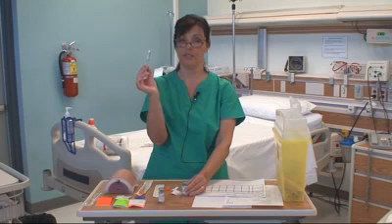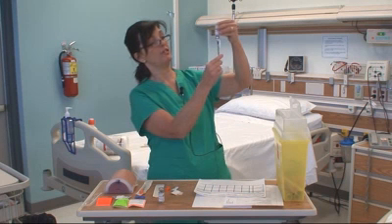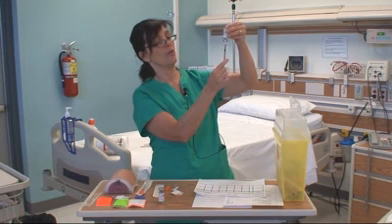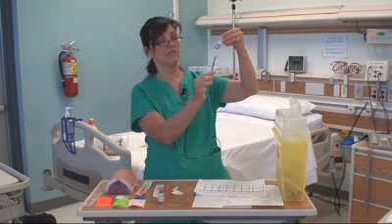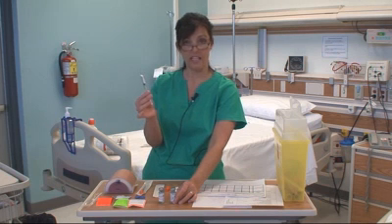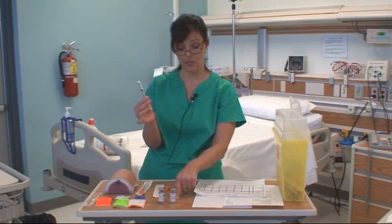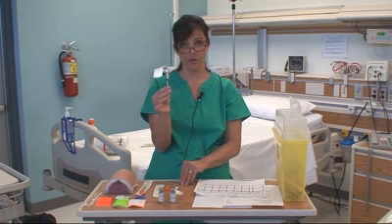Now I'm going to take that with the 4 units and put my needle into the Humulin N, and I'm going to pull the plunger back slowly until I get to 44 units. It's very important that you draw up the short-acting insulin first and the long-acting insulin second, because if by accident you got a little bit of the short-acting into the long-acting, it would not be a huge concern, but it could cause serious consequences if it were the other way around and the long-acting ended up in the short-acting bottle. So now I have 44 units of insulin.